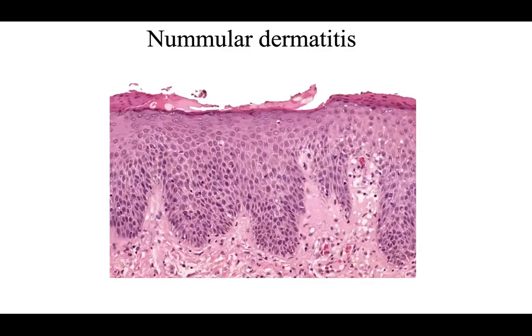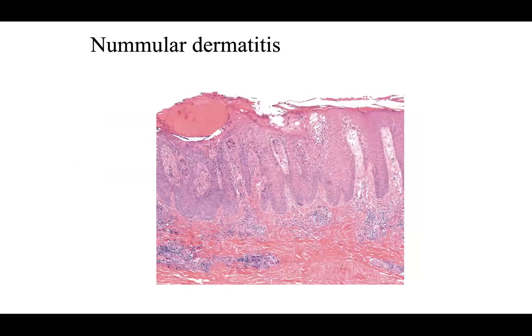Here's another classic subacute spongiotic dermatitis pattern for you. Again, more of the same at this point. Actually, it was becoming repetitive before because, again, the takeaway here is the spongiotic reaction pattern is representative of many different types of eczematous processes. You can see a nice crust. It may have been a spongiotic vesicle that ruptured and has had time to fill up with blood and serum containing crust. But this is a pretty subacute and it's kind of evolving into chronic because look how hyperplastic the epidermis is.